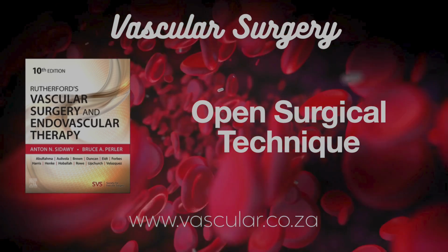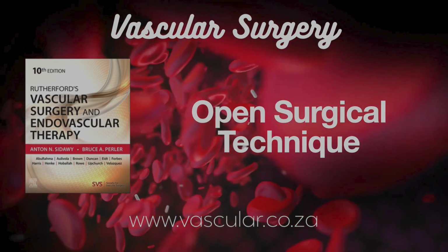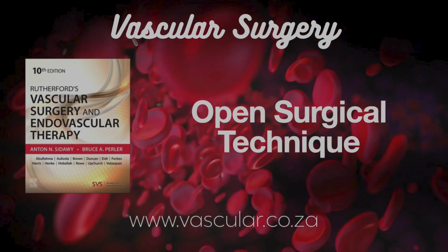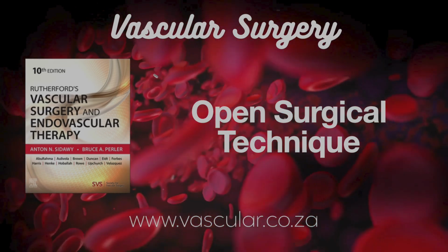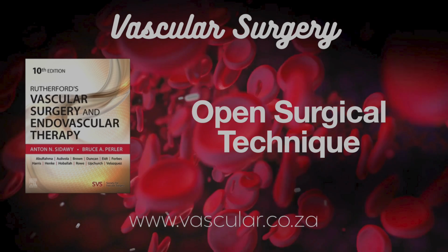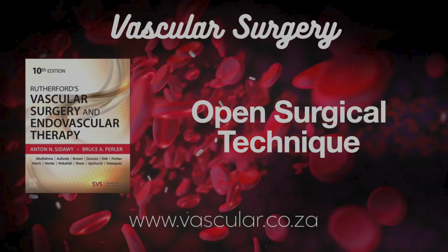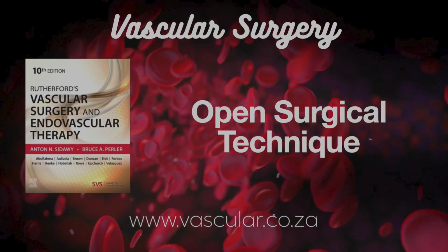Right. And PTFE sutures are designed specifically to minimize bleeding from needle holes, especially in PTFE grafts. But they need really secure knots. And the size varies. Definitely. Needle size, suture thickness, all chosen based on the vessel size. Okay. And the pipes, the grafts, when do they come into play? Grafts are essential when a section of blood vessel is diseased beyond repair or needs to be bypassed completely. Different types for different places.